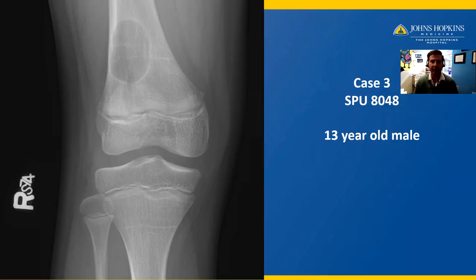Case number three is from a 13-year-old male. Here we have a lytic lesion in the distal femur metaphysis. The lesion is lytic, meaning dark or black, but it has a sclerotic — meaning a white line edge to it — which corresponds to new bone formation.